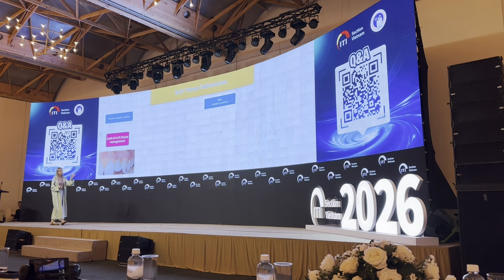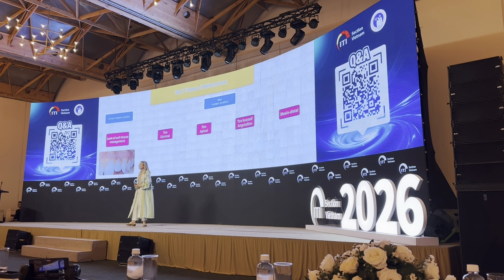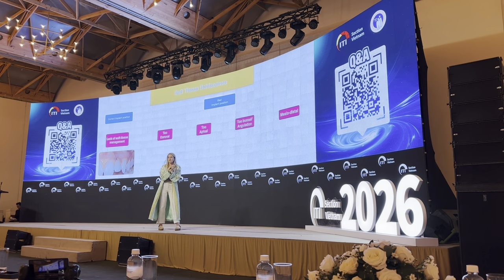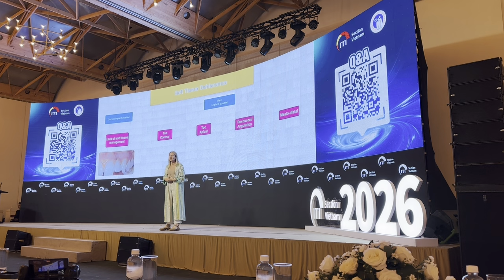The majority of the soft tissue dehiscence occur in implants that are positioned in a bad way. And you cannot imagine how bad you can place the implant in whatever type of direction. We have implants that are placed in a bad buccal-lingual position, in a bad mesio-distal position, in a bad apical-coronal position, so you can make mistakes 365 degrees.